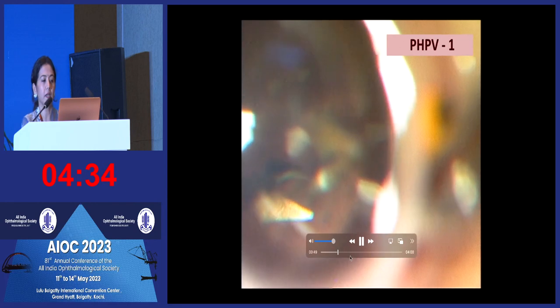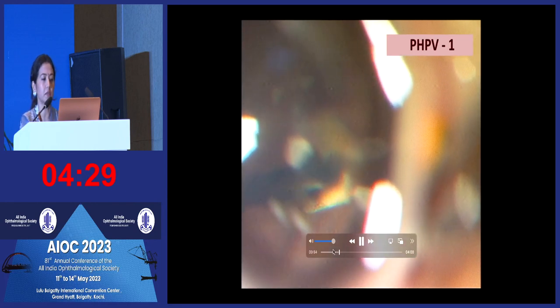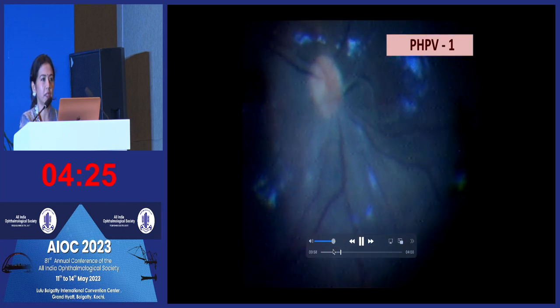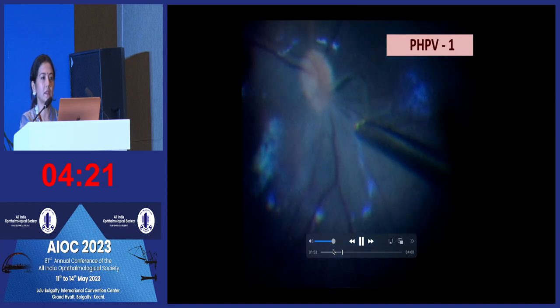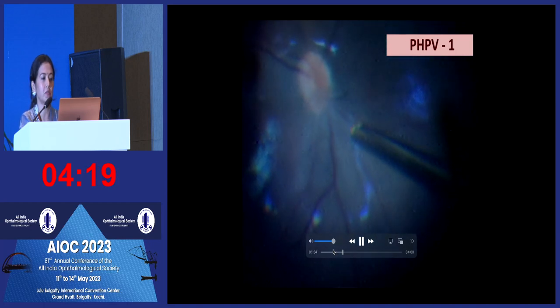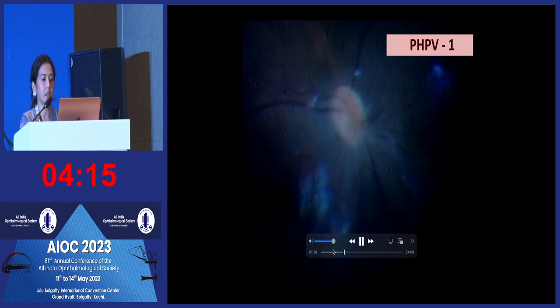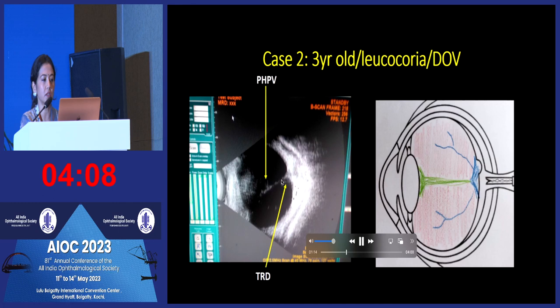So this was a bimanual dissection done under the microscope, and you tease out the membrane. It's like a Weiss's ring. Tease out the posterior tissue to behind the lens from the posterior capsule and then cut it. And once it gets cut from the posterior capsule, then you can just trim the stalk. We were lucky, it was a very fibrous kind of PHPV where there was not much blood. And you can see this is the stalk from the lens, and post-surgery it had resolved.